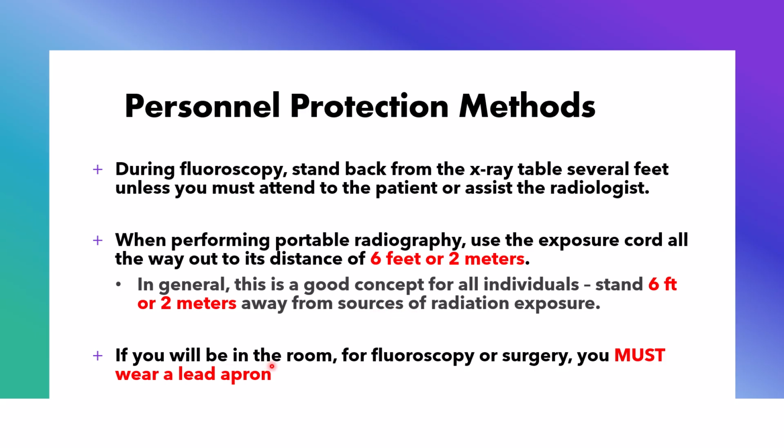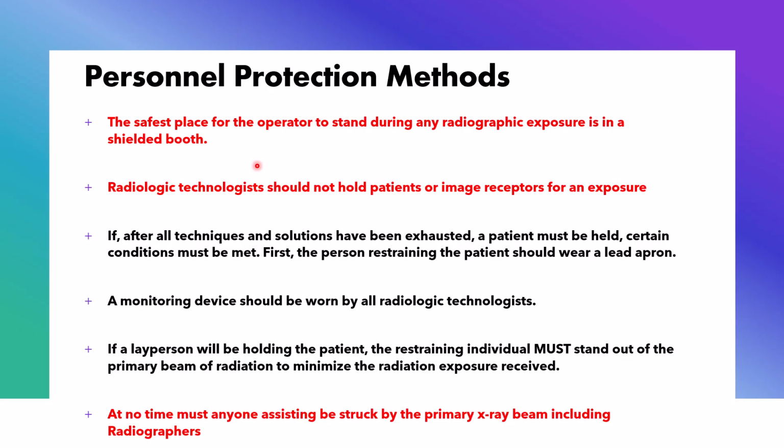If you will be in the room for fluoroscopy or surgery, you must wear a lead apron. The safest place for operators to stand during a radiographic exposure is in the shielded booth or in the back, behind the lead glass or the lead panel. Radiologic technologists should not hold patients or image receptors for an exposure. That is ideal, but that is not what's going to happen most of the time.